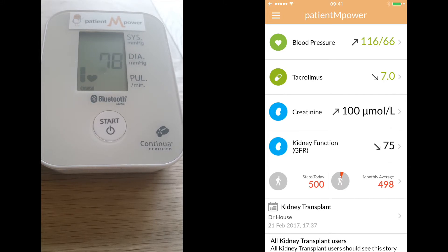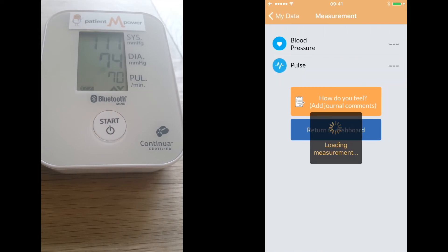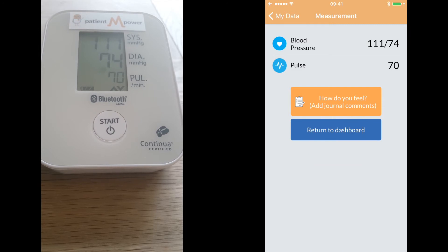Make sure you have the Patient Empower app open when conducting the measurement. When the measurement completes, the results will import automatically. At this stage, you can return to the dashboard, or you can also add a health journal to add comments about how you feel when you conducted the measurement.